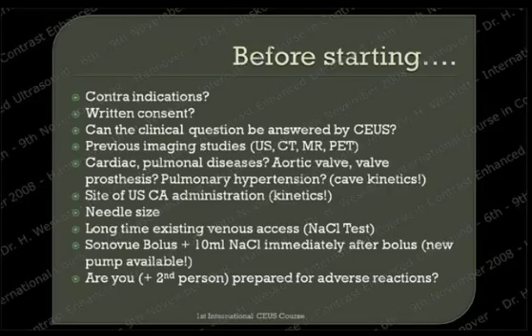SonoVue bolus plus 10 ml saline immediately after the bolus. This is, of course, a standard procedure. Sometimes, for very special questions, you can also perform an infusion of contrast agent. We now have, and it's just arrived, a pump where two syringes are mounted. One is for the contrast agent and one is for saline. So when you activate the pump, you first get the contrast agent as a bolus, and automatically afterwards the 10 ml bolus of saline.